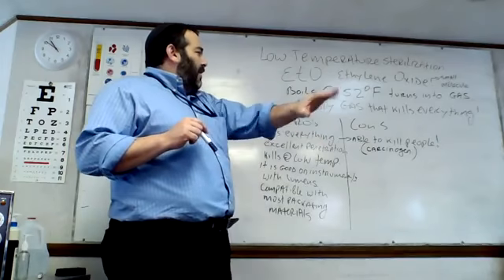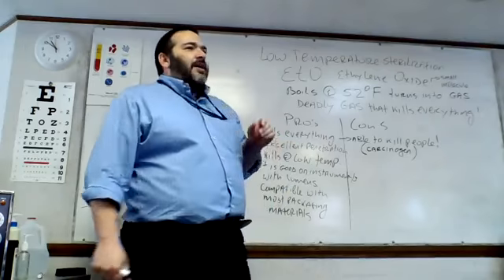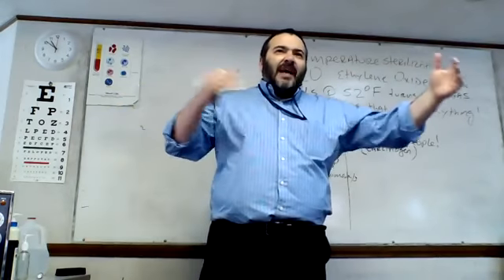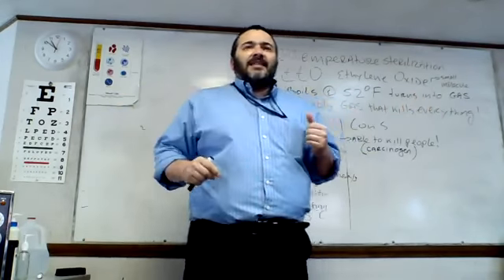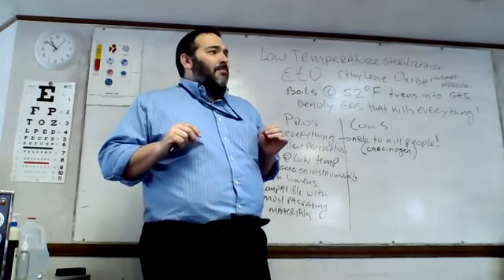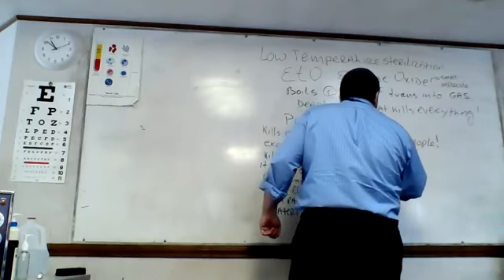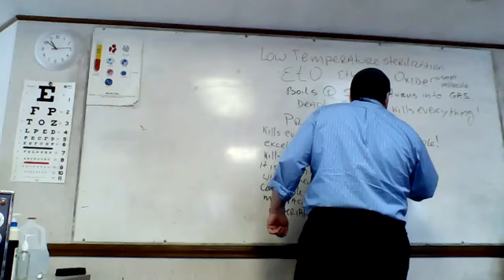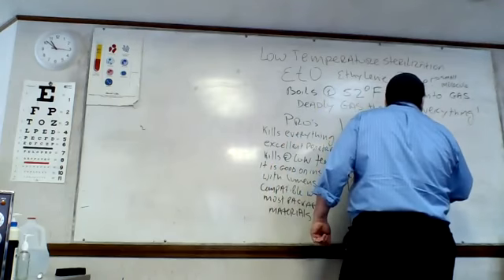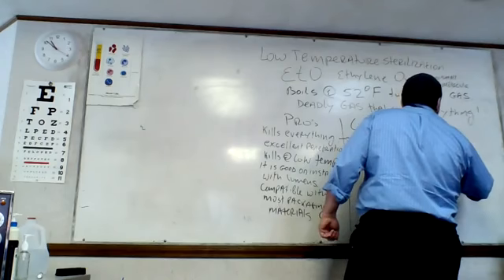Before I get into other things, if it's able to kill people, then people and spaces where this is being utilized have to be very carefully monitored. Okay? Requires space and personnel monitoring.